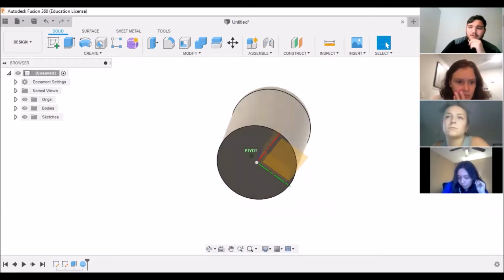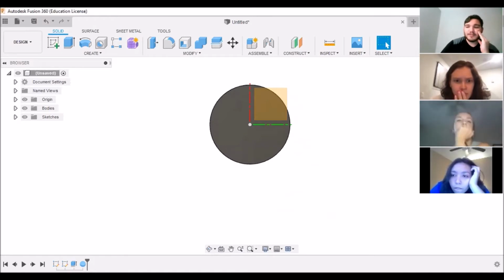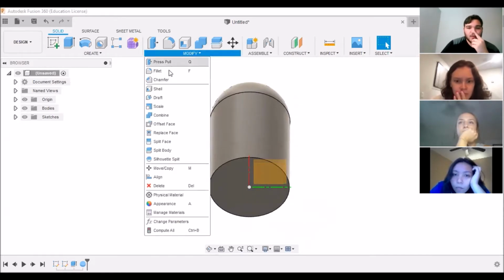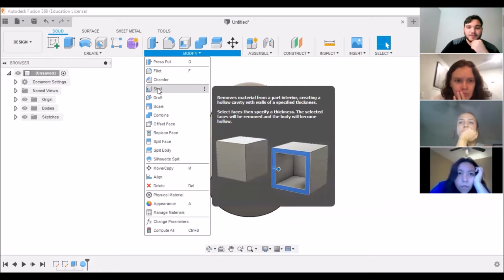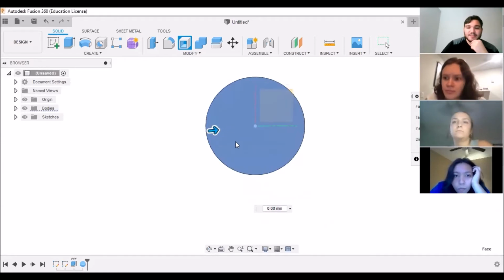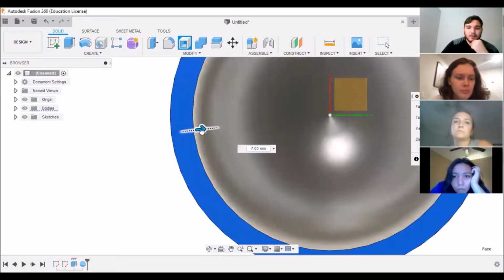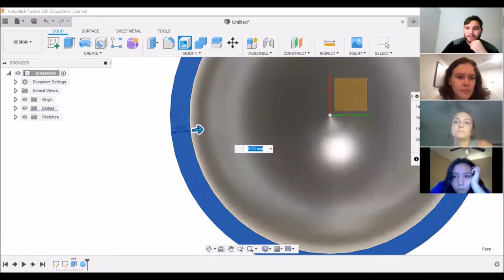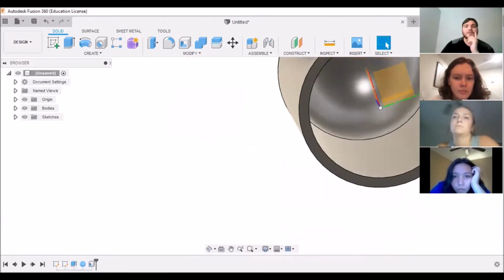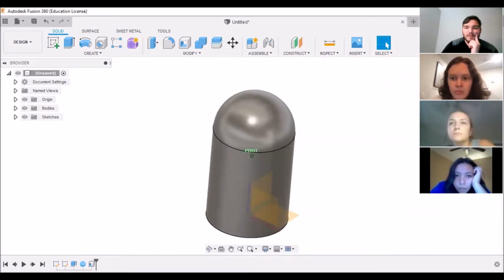Something that we can do to hollow this out a little bit: let's say we want to put a mechanism in the fingertip for a prosthetic finger. It doesn't really work too well if it's dense and solid. So we can go to our modify tool, shell, and if we select the bottom face, we can create a thickness that stays constant throughout the entire body. If we press OK, now it's essentially like we have an empty little capsule head. Or like a thimble. A thimble's a good example.